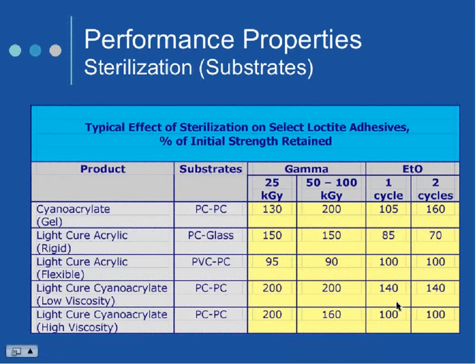So this is a slide. It doesn't really identify the adhesive, but I could go back and find that for you. It was done for a white paper. And what you notice is we used a variety of cyanoacrylates and acrylics, and we measured resistance of different substrates, or initial strength, I should say, retained, all the way up to 100 kilograys cumulative, right? So nothing there that really gives me any kind of pause. ETO or EO, 1-2 cycles. The one that really concerns me is this one.